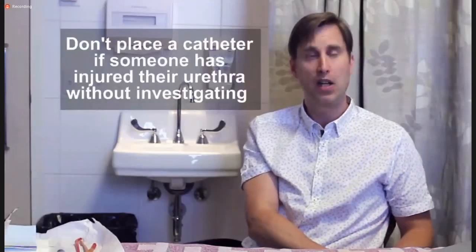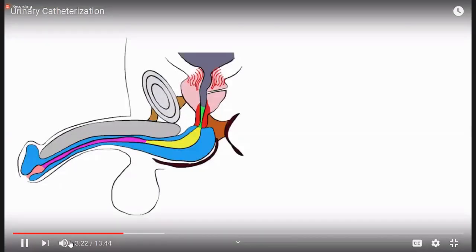There are some cases where you wouldn't want to put a catheter in someone's urethra, and that would be the unique circumstance where someone sustained a pelvic fracture and has injured their urethra. In those cases, you want to do a urethrogram and assess the status of the urethra before putting a urinary catheter.